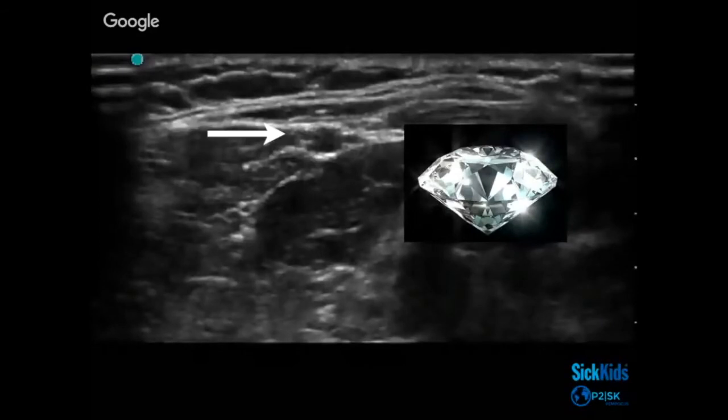And how? Actually, it's just by fanning your probe. If you look at the area of interest, you know that there is a nerve there, but you're not able to see it, just fan through. And by doing it, you're going to see that it lights up, it lights down. And so then you know where the nerve is. That's pretty useful.